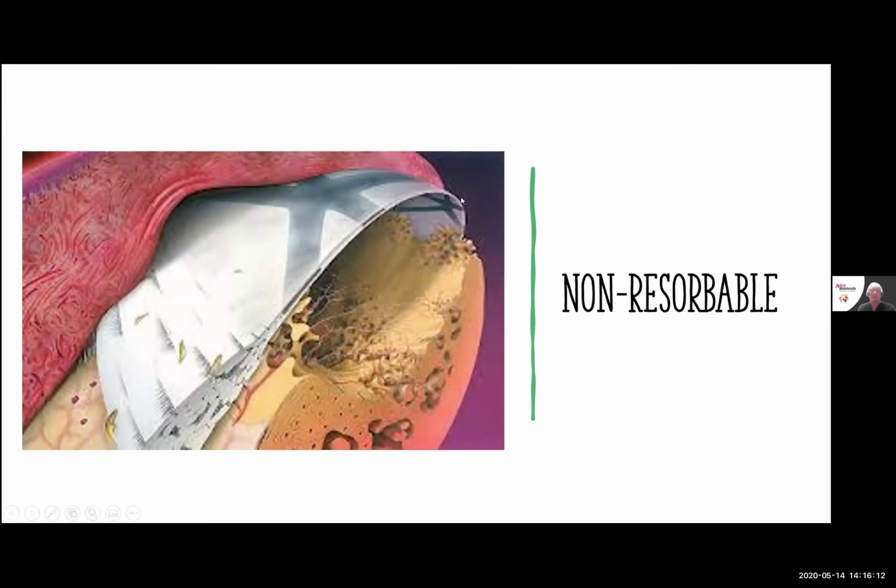This framework will hold the space while the bone graft particulate underneath adheres and begins growing, then stabilizes and becomes the new part of the bone recipient site and the bone graft material for our future implant.